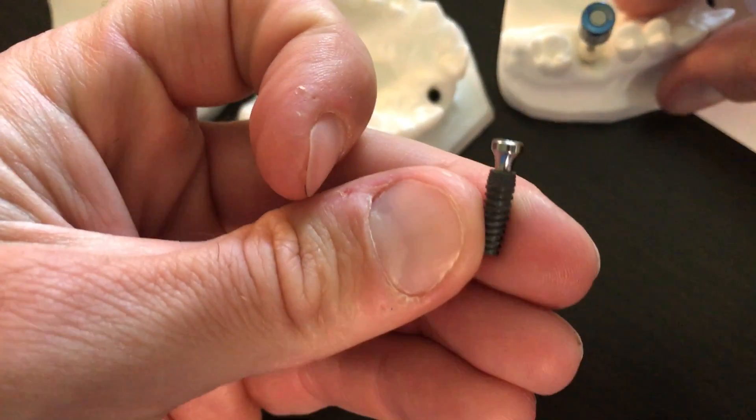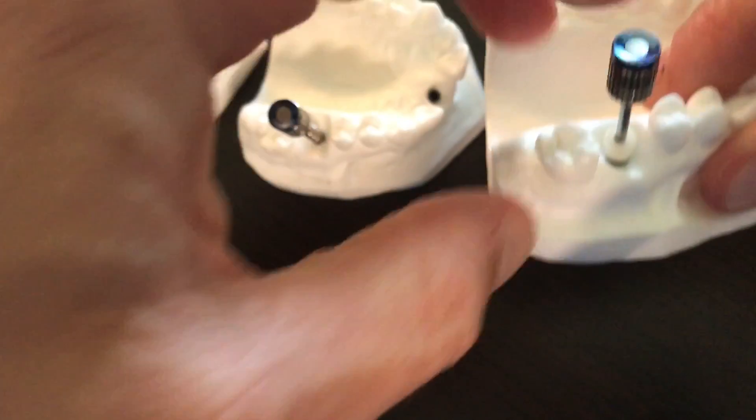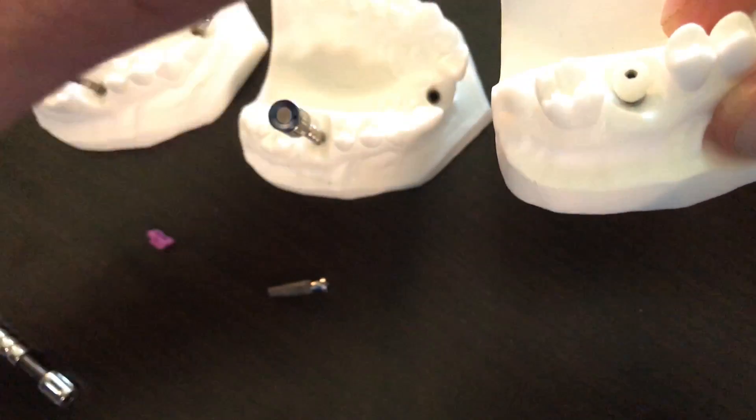We have this type of abutment. This happens to be a 4.5 by, I think, a 3.5 height. But we even have something that's a customized, semi-customized — it's a peek material from Revo Dental Lab. Some other labs are making this as well.